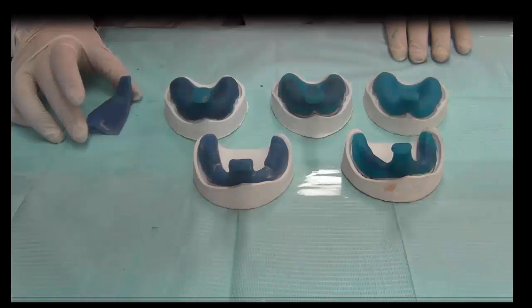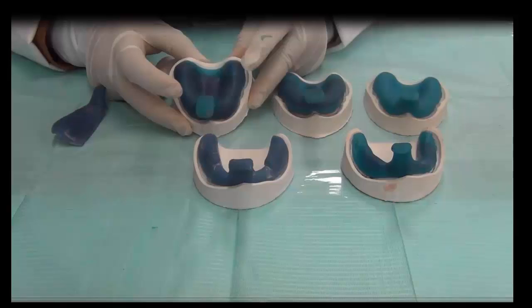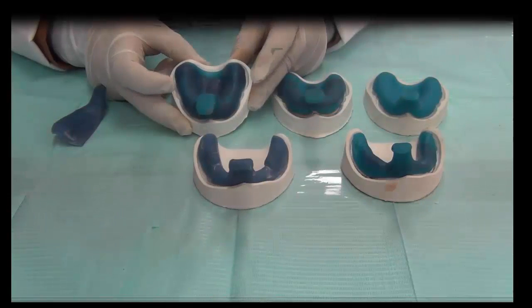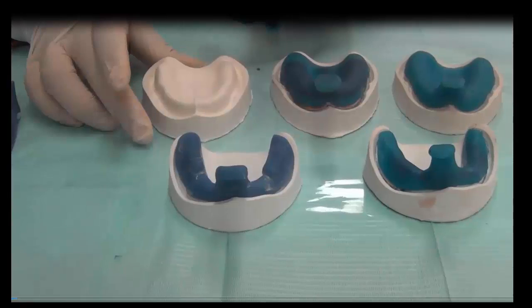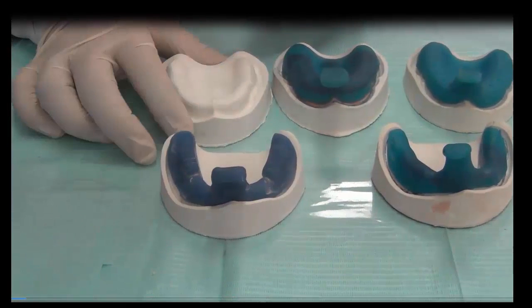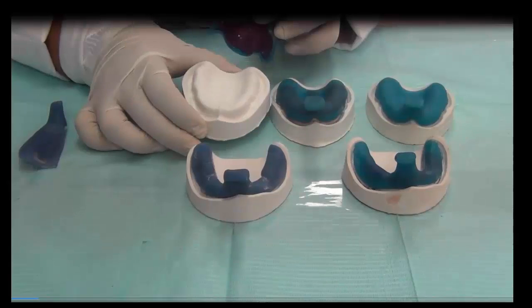Now we're going to talk about the gross features of trays. A custom tray could be made of light cure material or cold cure material, acrylic material, and they fit on the primary cast. So this was the primary cast that we made out of our primary impressions from the patient's mouth. Primary casts have been made from the impression from stock trays, and it's not very accurate. Not a lot of detail that we got here.